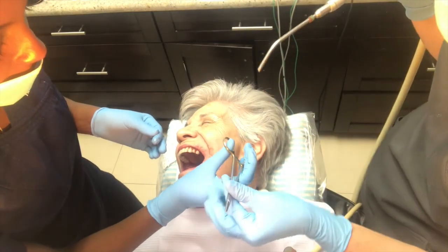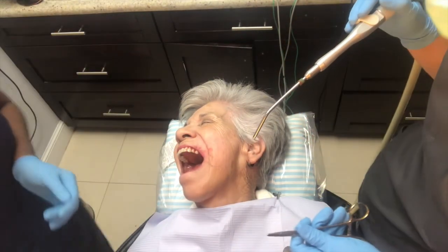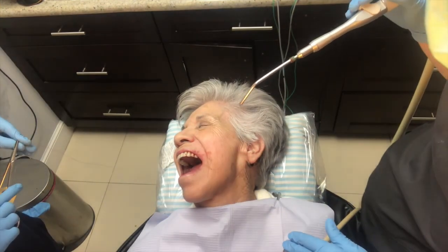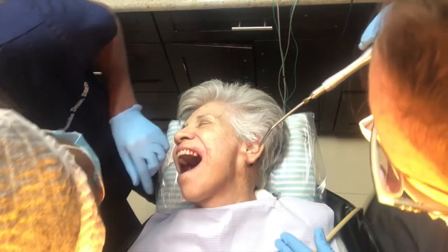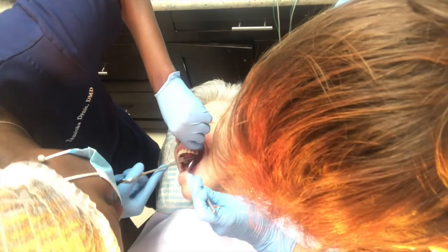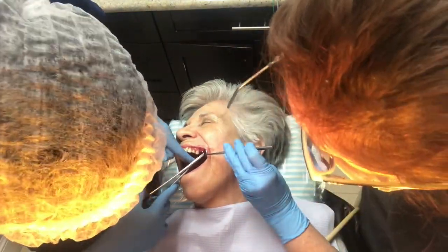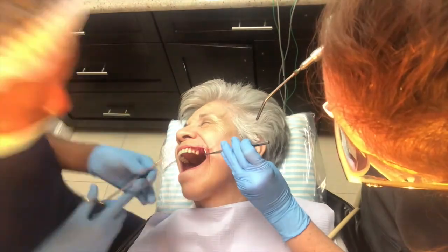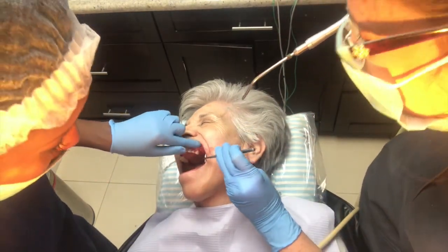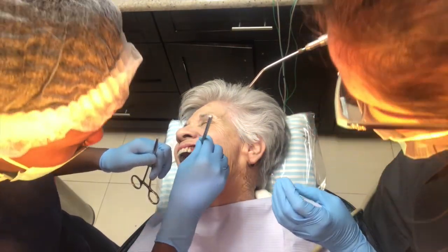I tell people, even though I don't typically see them for another 2 weeks, that they're always welcome to come back if they feel like something is not right, if they're concerned. Because I've been through having dental implants myself and I do them so often, I pretty much know what most people are going to experience and feel, and I try to detail it to them. Usually during the suturing process, I'm doing a lot of talking about post-operative instructions and the medications they're going to be using. Even though I know they're not in the clearest state of mind because they're still in the middle of their procedure, everything is written on paper. And if they have a family member with them, she had her daughter with her that day, I usually explain to the loved one as well, so that they fully understand what we did and how to care for everything well.